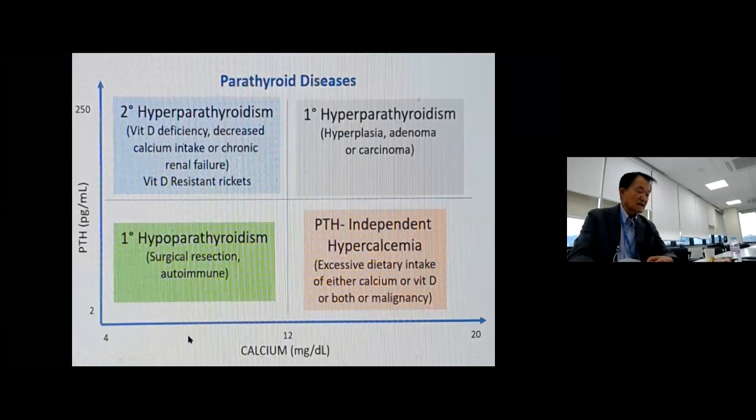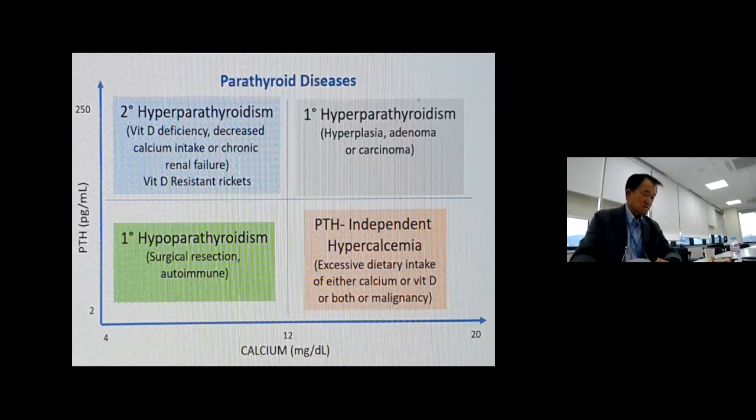The calcium level here is usually greater than 10.5, but about 12 milligram percent here. If the calcium level is greater than 11, we generally see the adenoma on images. Less than 11, it's very difficult because it's all small lesions. So this calcium level seems to correlate with our imaging results.